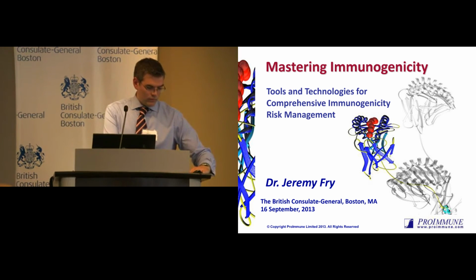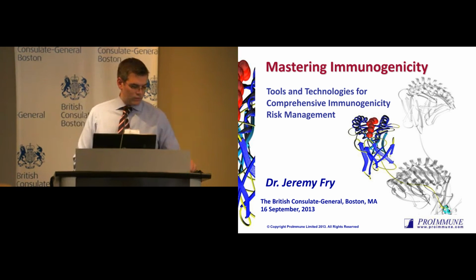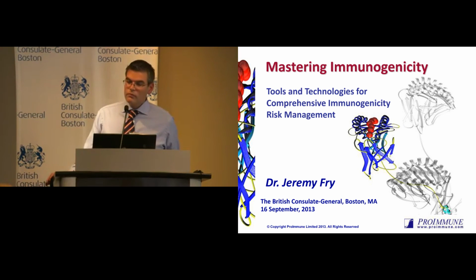And CAMPATH gives you a very reliably nearly 100% response across the board, so it's a nice positive level. And both drugs are obviously available off the shelf, so that's why we like to use them, because we know we'll be able to buy them in the future and put them in the assay.